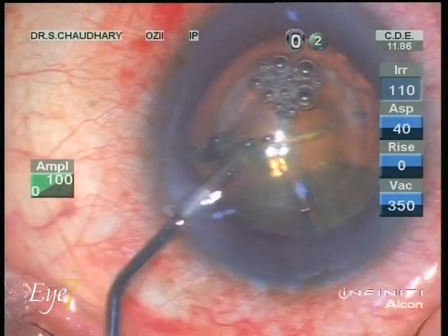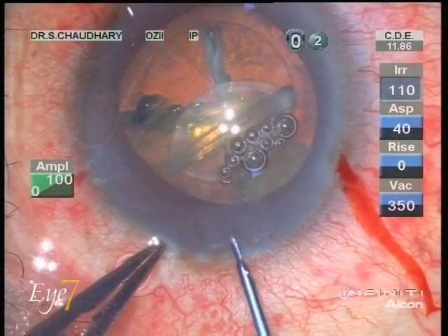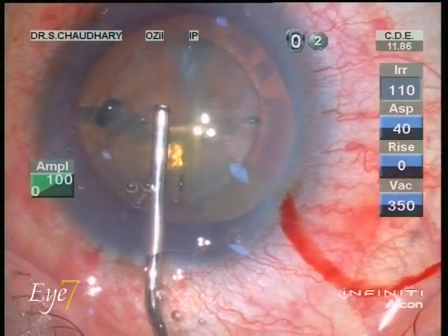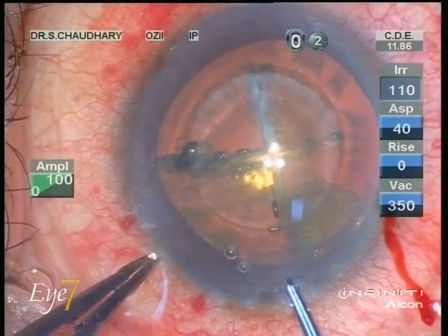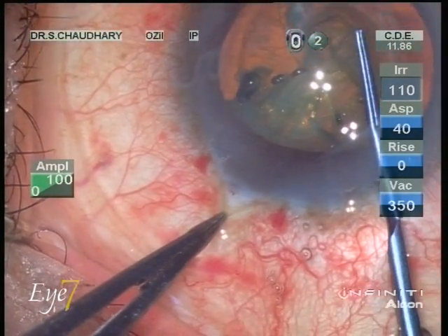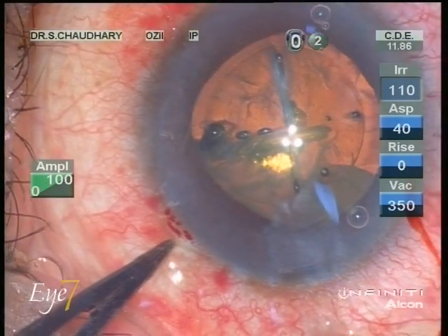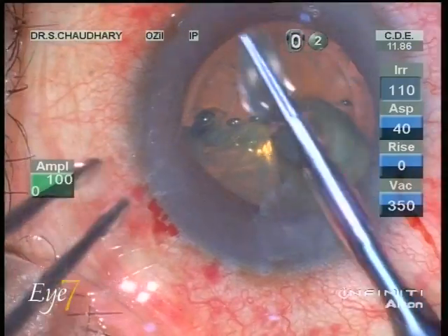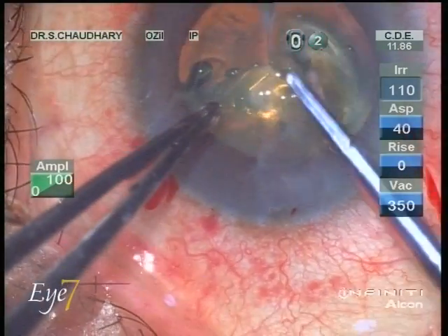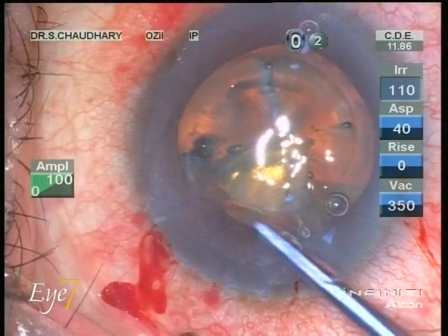After the femtosecond laser part is over, we bring the patient to the operation theater. From the side incision we fill up viscoelastic, and you can see that the anterior capsule has moved from its position — it was fairly well cut and detached. Now from the main incision, with the rhexis forceps, we detach the anterior capsule from its side edges, completing the CCC tear.